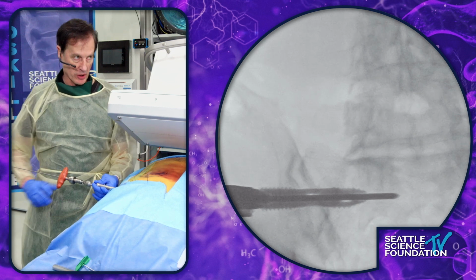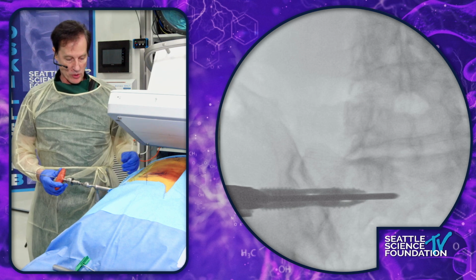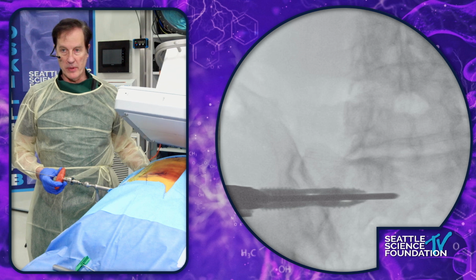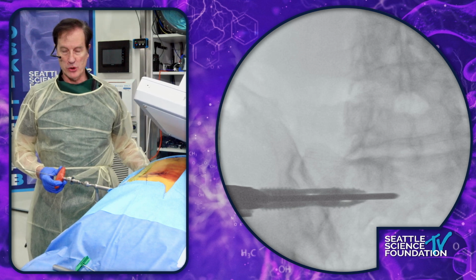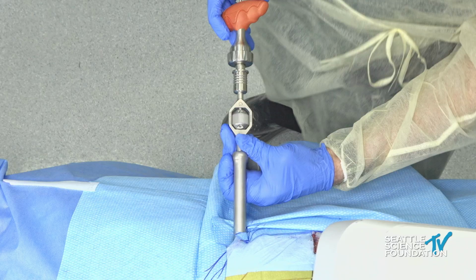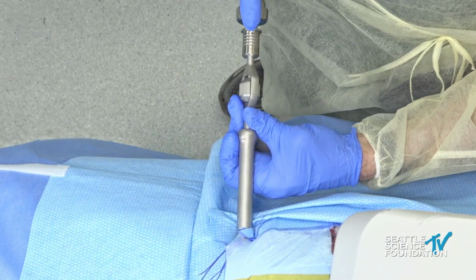Now, if you could arc about 15 degrees toward you, we're going to look down the ilium and make sure that the back end aligns with the posterior portion of the ilium. And this is something to be able to make sure that you have it flush. You don't want to countersink it. You don't want to leave it proud. And so you can see the line that is right at the posterior margin of the screw. I'm going to advance it just a little bit.